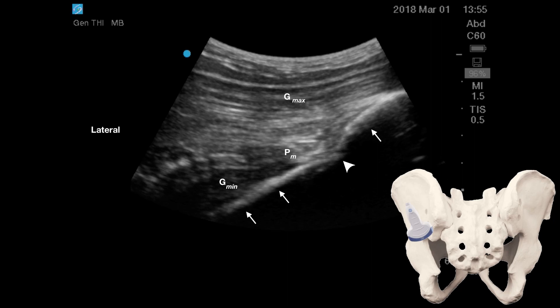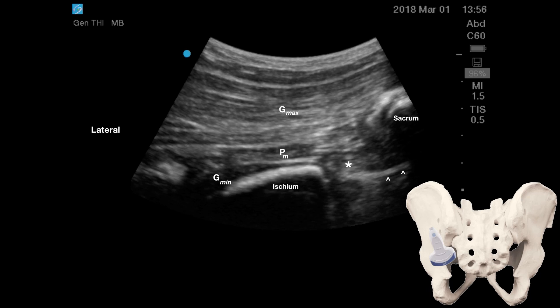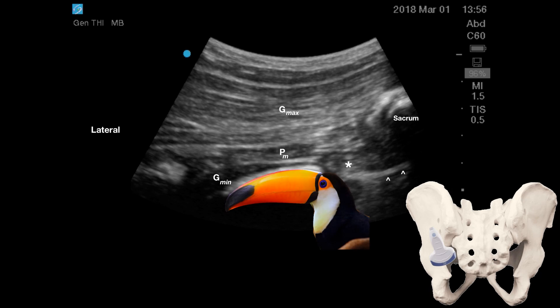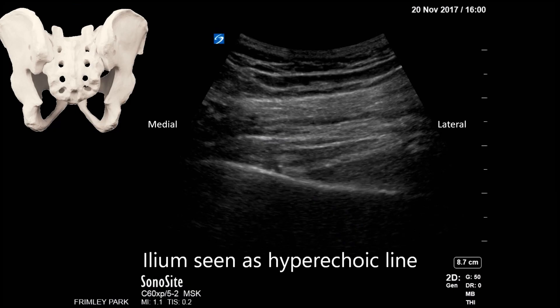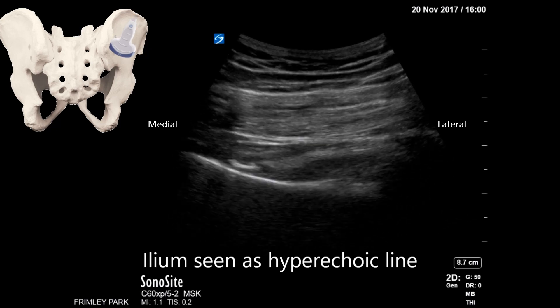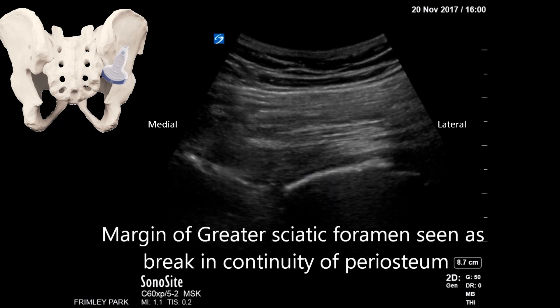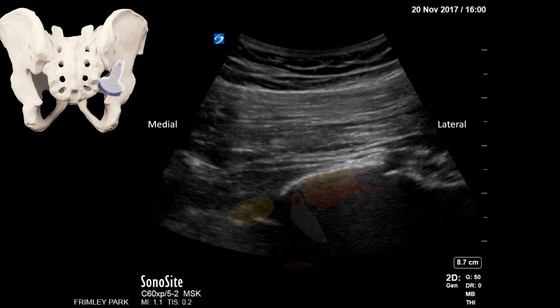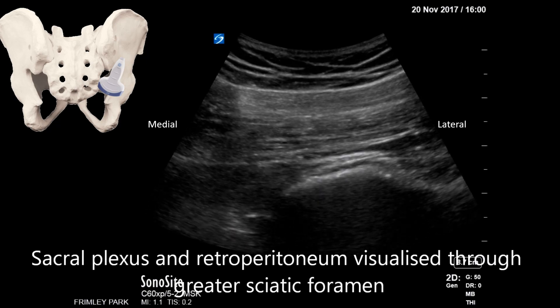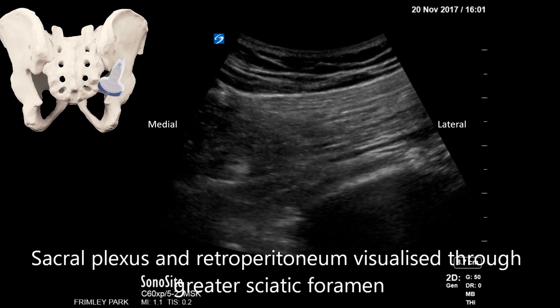As the probe is moved inferiorly, the discontinuity in the ileum represents the greater sciatic notch. Moving inferomedially, the curved hyperechoic contour of the posterior border of the ischium is visualized, with the sacral plexus lying medial to it. The posterior border of the ischium resembles a toucan's bill. The scanning video shows the probe moved from superolateral to inferomedial, identifying the ileum, the greater sciatic notch, the posterior border of the ischium, the sacral plexus medial to it, and the retroperitoneum anterior to the sacral plexus.